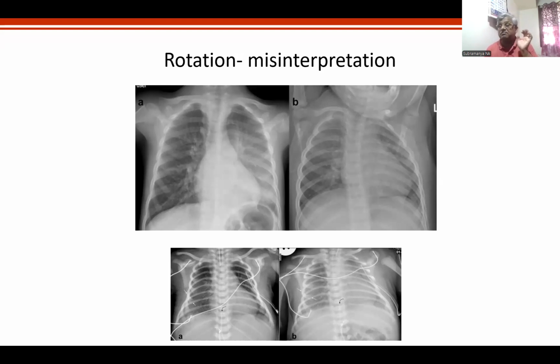Basically, CT is an X-ray. It is computed X-ray. In the olden days, we had what is called tomography. Tomography meant there was an X-ray and a film moving like that. At the point of the fulcrum or the focal point, if you have forgotten physics, or in a camera, what is called the focus, your lesion should be at the point of the focus, and you take those images. This was called X-ray tomography. It was conventional, which was improvised with computerized images. It's called computerized tomography, and that is what we mean by CT.